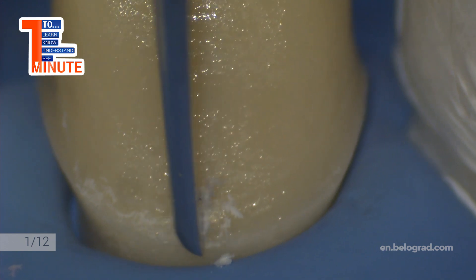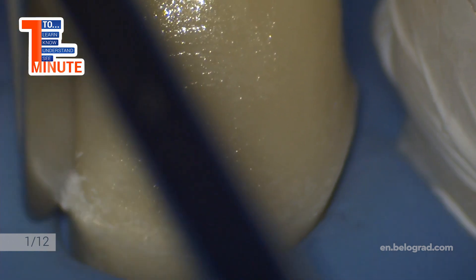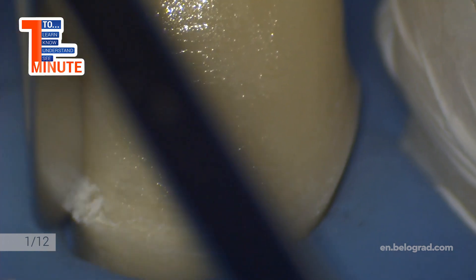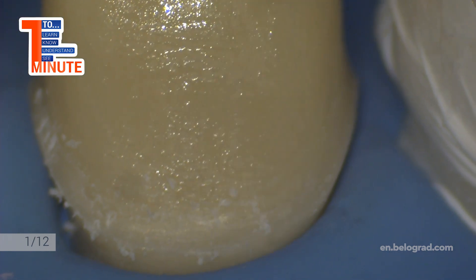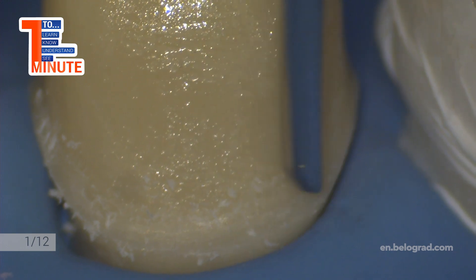Then we cover all surface with glycerin gel and light cure for one minute. Now we need to clean the finish line from adhesive; instruments that can be used are enamel chisel or curette.